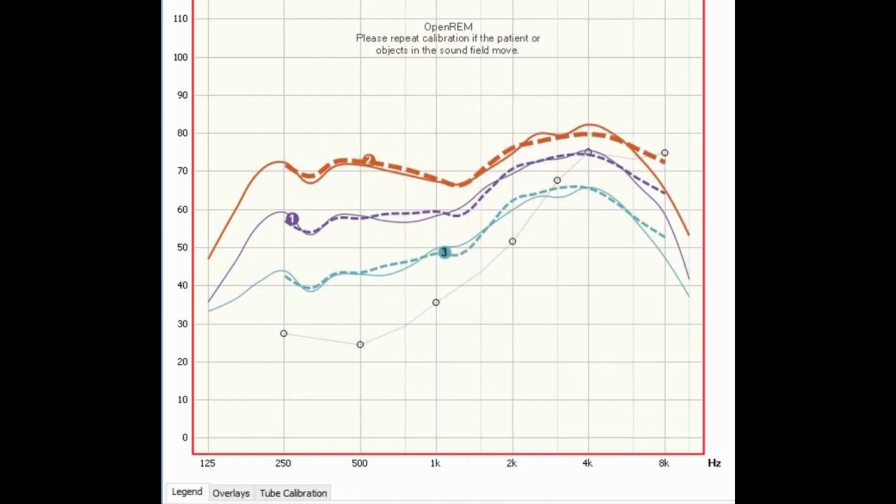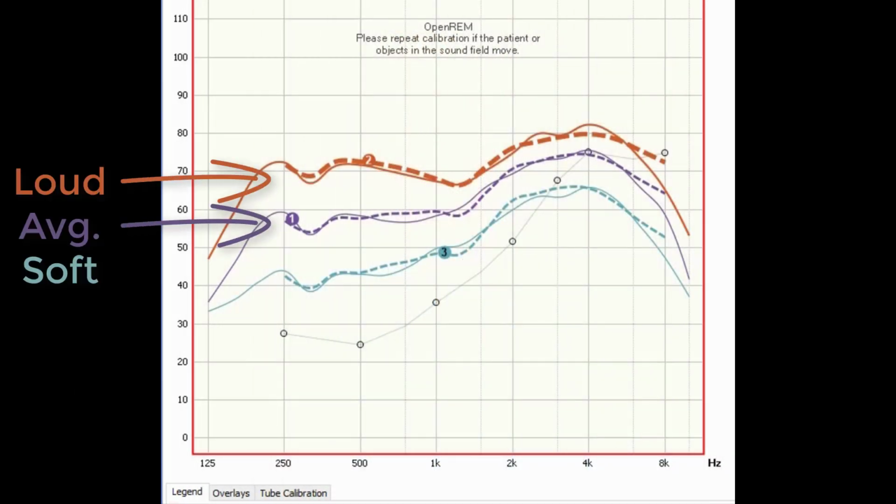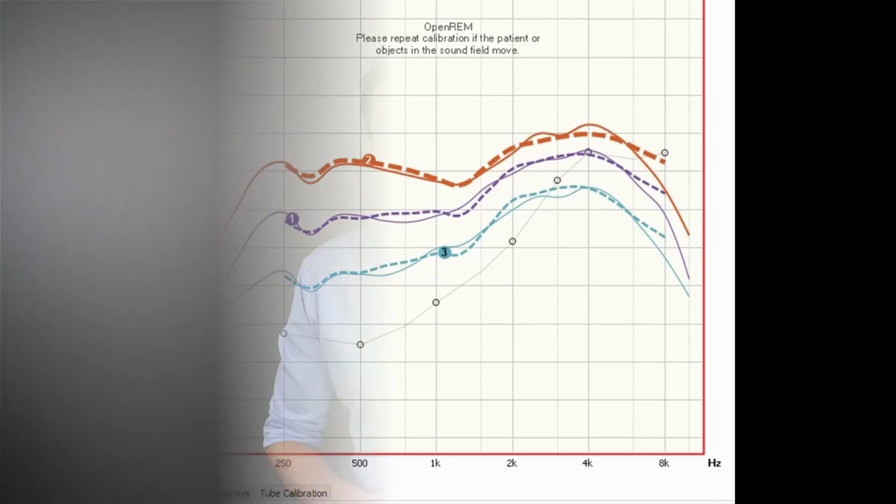When verifying hearing aid programming using real ear measurement, your provider should be measuring and making adjustments for average, loud, and soft level speech inputs. With today's modern hearing aid technology, we don't have to amplify all sounds equally. That is what hearing aids back in the day used to do. Now we have the ability to give different levels of amplification based on the level of input that is coming into the hearing aid. Think of it this way. If you have someone who's yelling at you, we need to give less amplification to that signal compared to if someone is whispering to you.